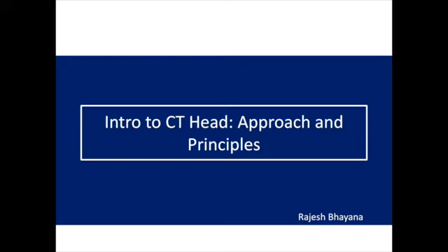This talk is intended to serve as a good introduction to CT head. If you're a new radiology resident, you must understand the basic concepts presented here so that you have a strong base to build on moving forwards. If you're a generalist, whether you be in emergency medicine, internal medicine, or whatever, this will give you more than enough to start looking at CT heads right away.